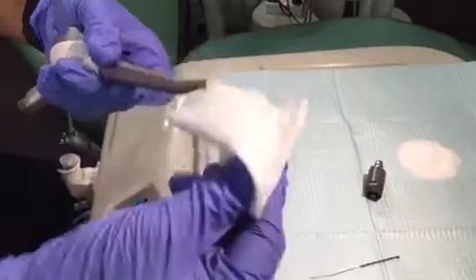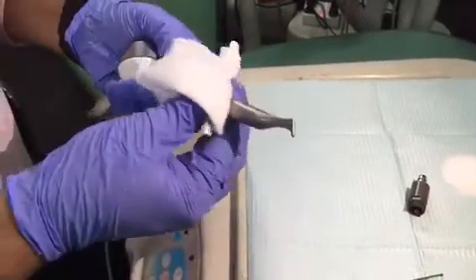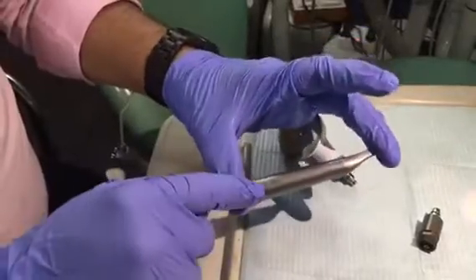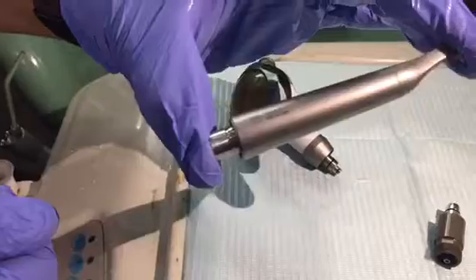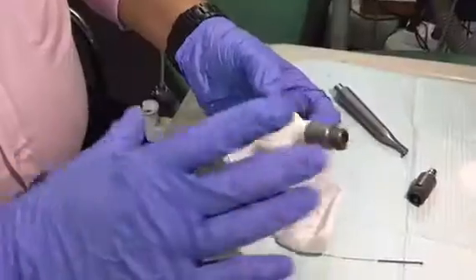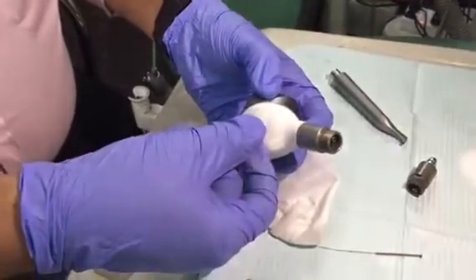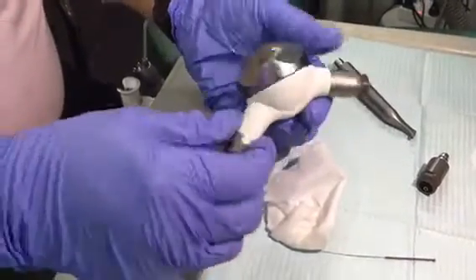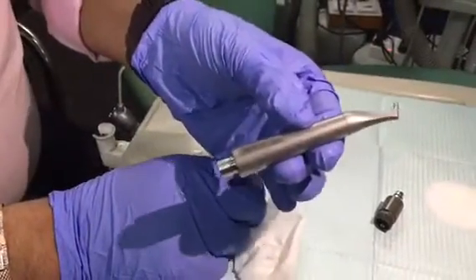To maintain the head, always wipe it clean with an alcohol swab or a wet wipe. This is the simplest alcohol swab you can get. This handpiece head is autoclavable, so you can put it in an autoclavable pouch and put it inside the autoclave. Never put the body in an autoclave. This is made of some plastic components, they might melt, so never put the body inside an autoclave. Only the head is autoclavable.